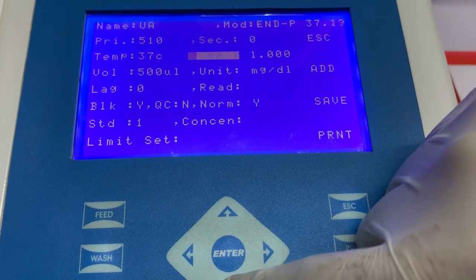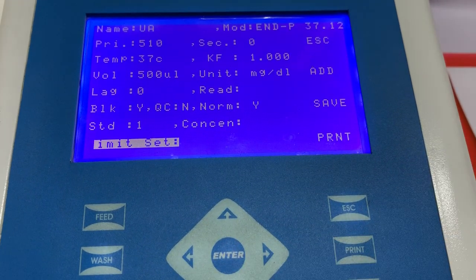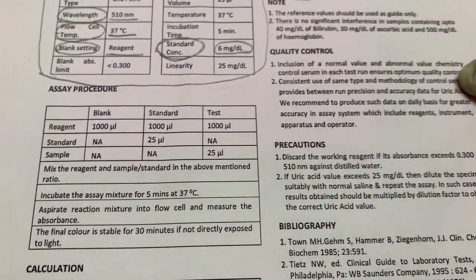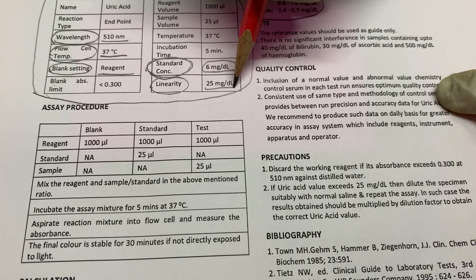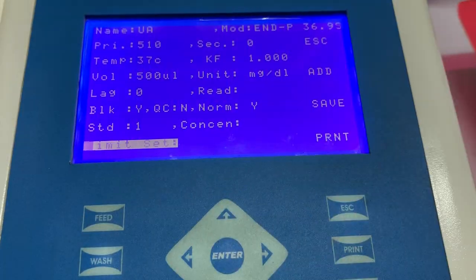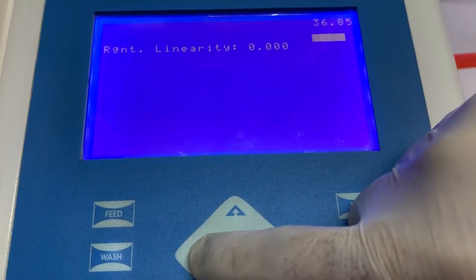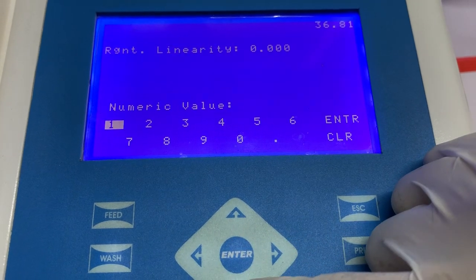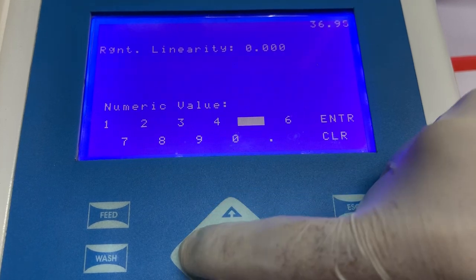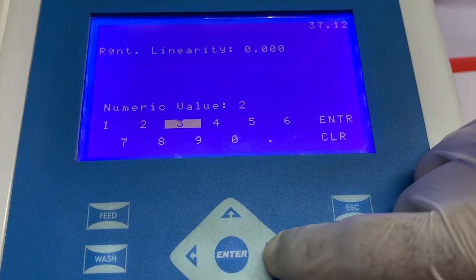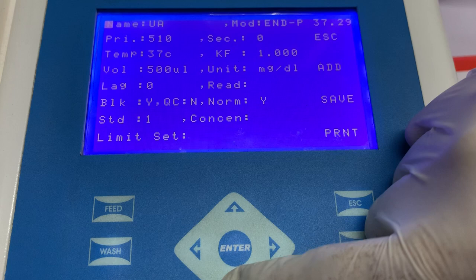Next, we have to enter the value of limit set, or reagent linearity limit. Again, this information can be seen in the instructions for use, where the manufacturer clearly mentions what the linearity of the kit is. To enter the value, select the option of limit settings and then select reagent linearity limit, and enter the numerical value mentioned in the instructions for use. Press enter and escape to come back to the home screen.